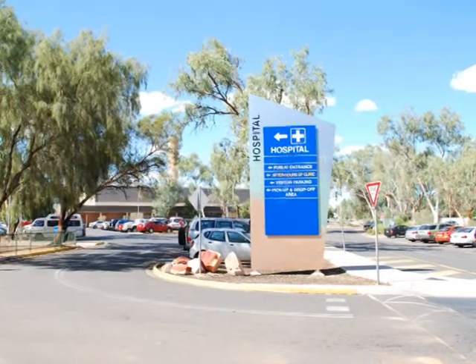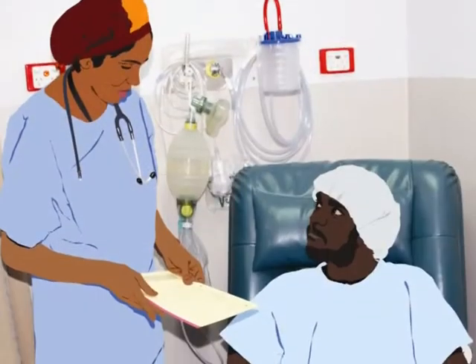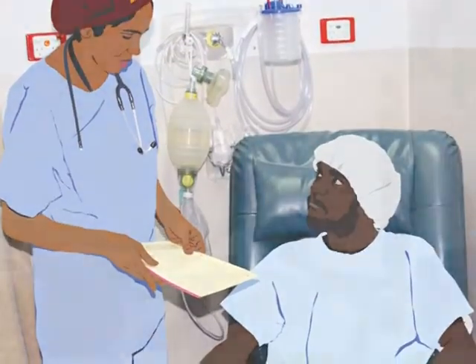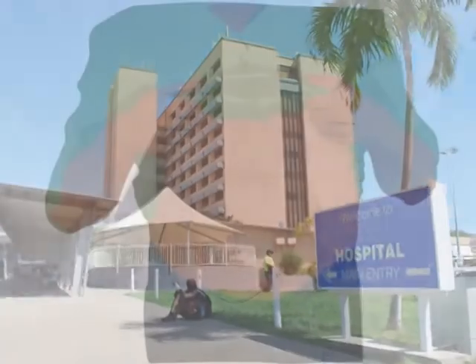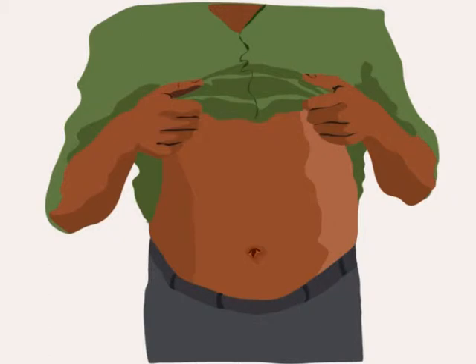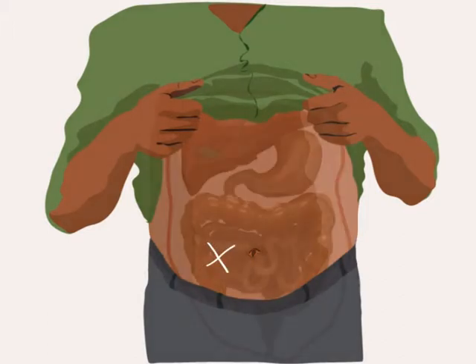To do PD, first you have to have an operation at the hospital. The doctor will make a small hole into your peritoneum. The doctor will put a small soft tube into this hole.